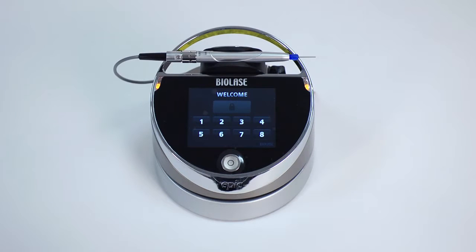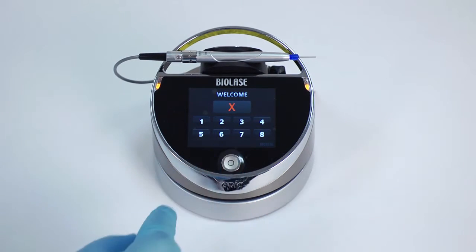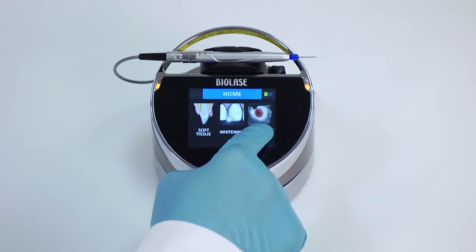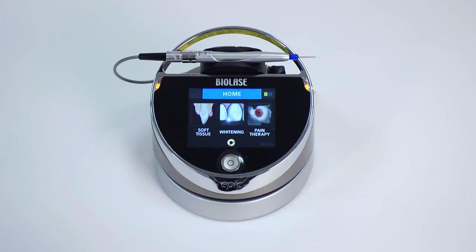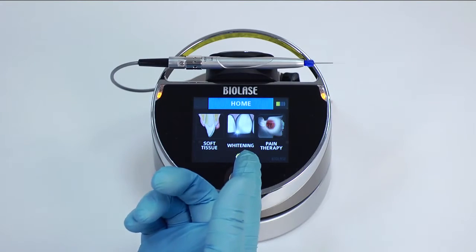Enter the 3-digit key access code, which is 888. If the code is incorrect, a red X will appear and the screen will revert to its original state. Once the correct code has been entered, EPIC will display the home screen, which has 3 procedure categories to choose from: soft tissue, whitening, and pain therapy.